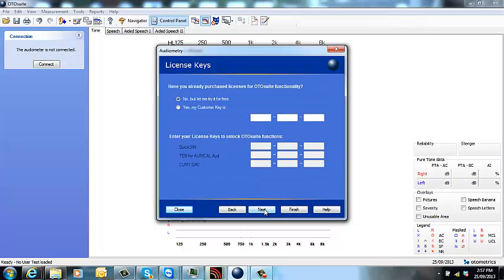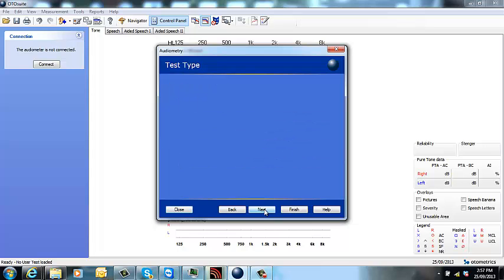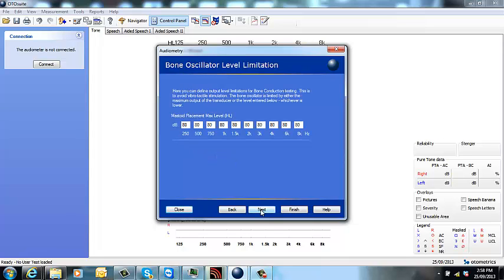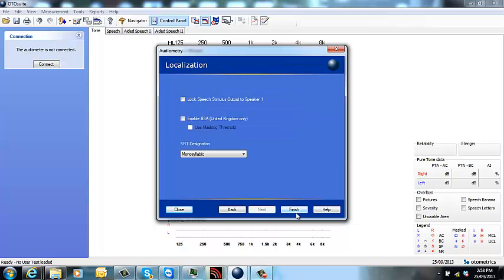This is where you'll need to fill in your appropriate license keys which you will receive with your new Oracle. Now these different test types, most of you won't need to have them selected. Some of you may use the QuickSIN test. You will need the separate license key to access that. That just tells you the maximum level that your bone conductor can go to and then click finish.